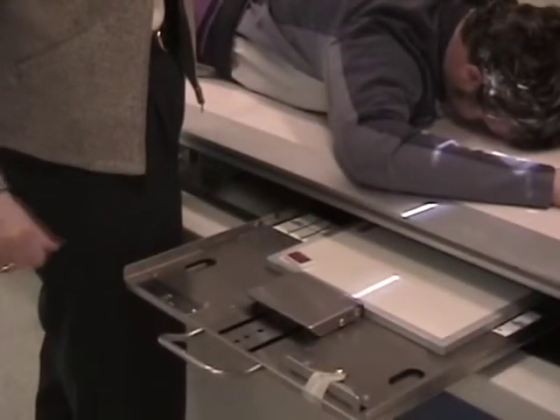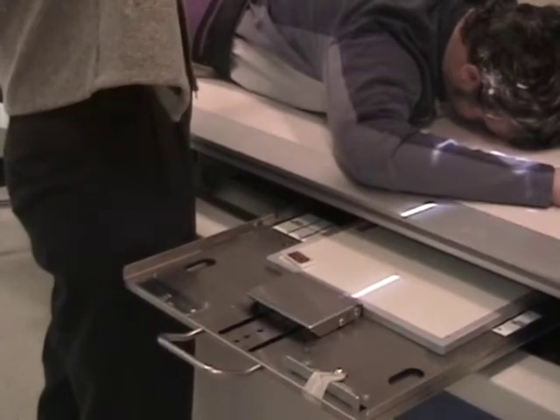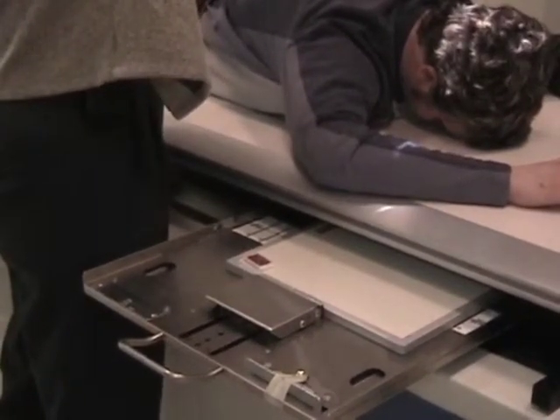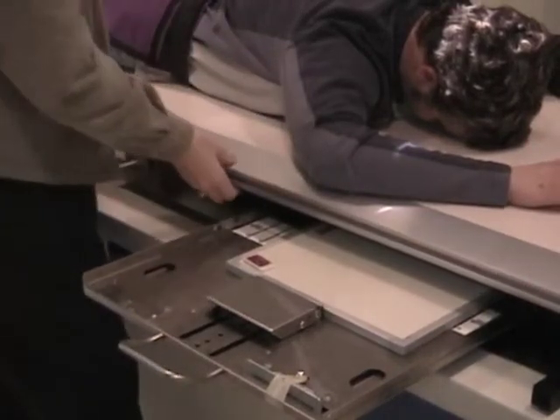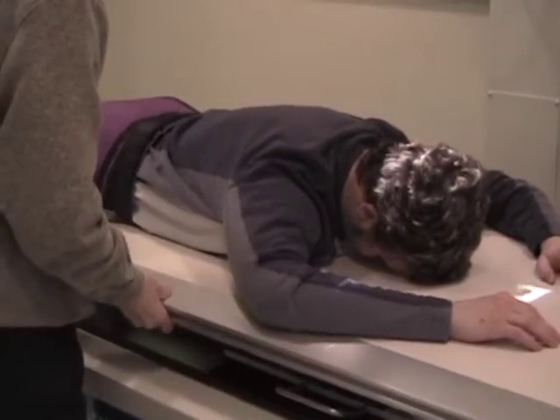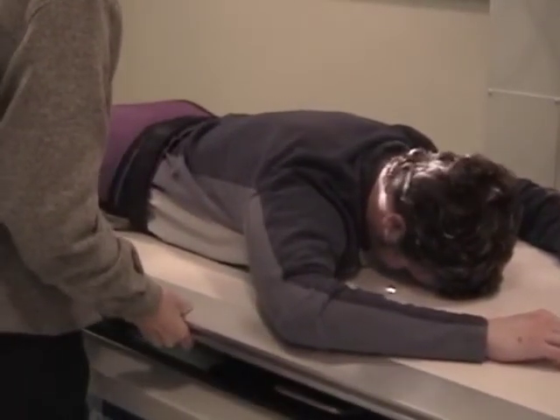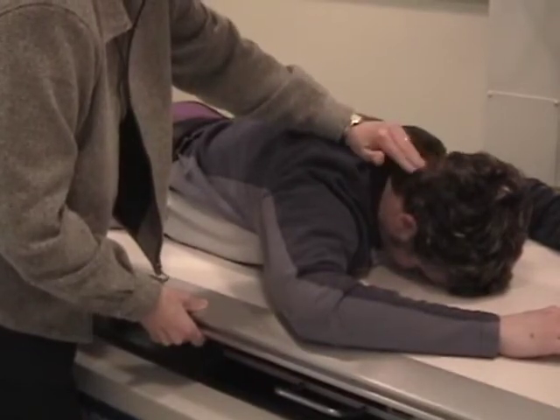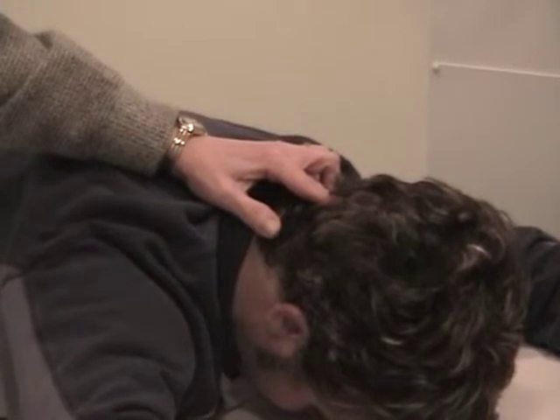And then I'm going to float my patient to where I need them to be. 25-degree cephalic tube angle. I've adjusted the gauge to maintain my 40. And now I'm going to float the tabletop, float my patient to where the inion, feel on the back of your skull, the bump on the back of your skull, it's referred to as the inion, I-N-I-O-N. It's actually the external occipital protuberance.